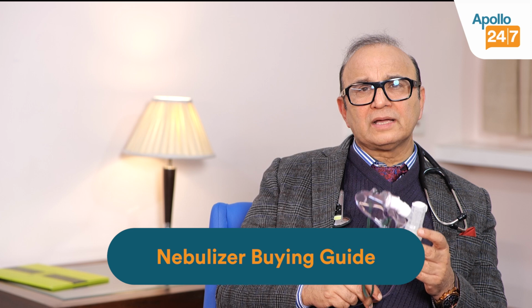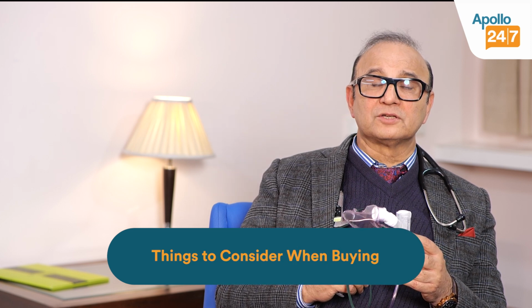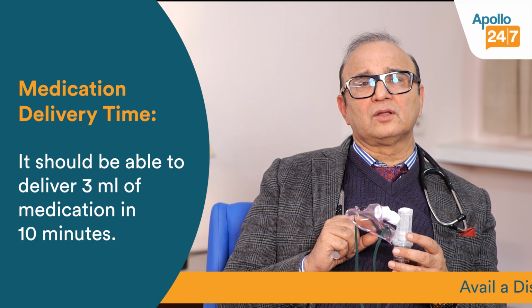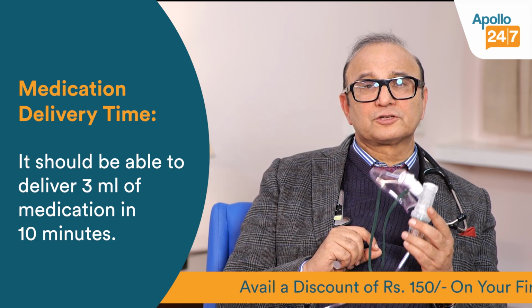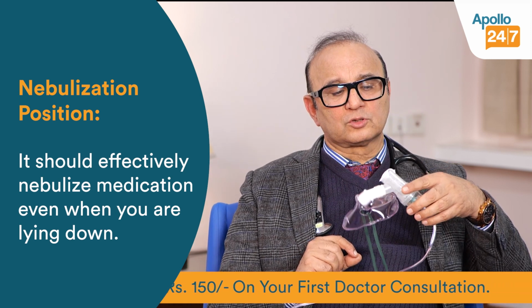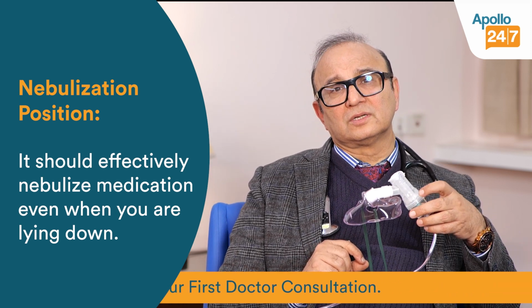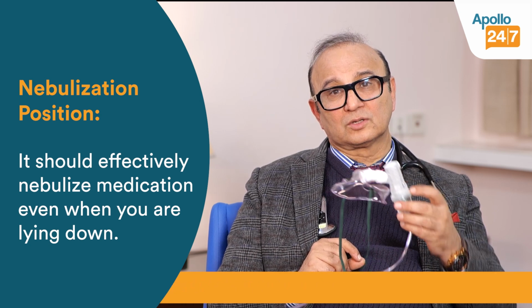When you go to buy a nebulizer, there are a few things which you must keep in your mind. One is, when you're buying a nebulizer with the electrical compressor, you should see that 3 ml of the drug should finish in about 10 minutes. And then it should nebulize not only in the standing position, it should also nebulize when it is horizontal, particularly when you're sick and you're lying down.